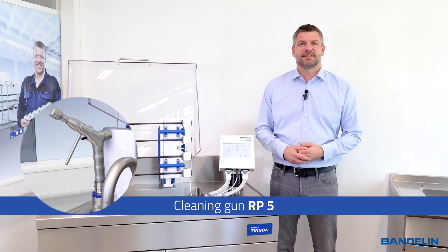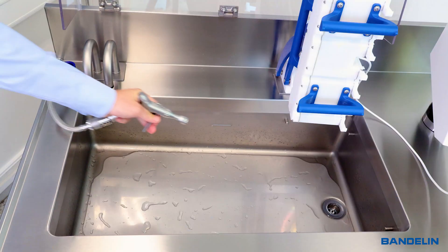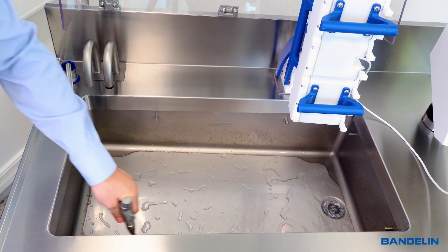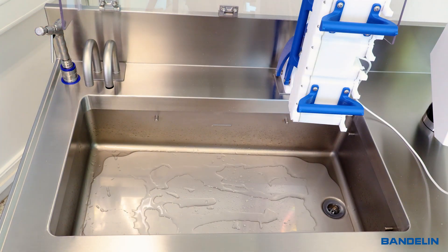The integrated cleaning gun is practical for thoroughly rinsing out the oscillating tank after emptying. Instruments can also be rinsed in the ultrasonic bath after cleaning. The cleaning gun can be thermally disinfected and sterilized.